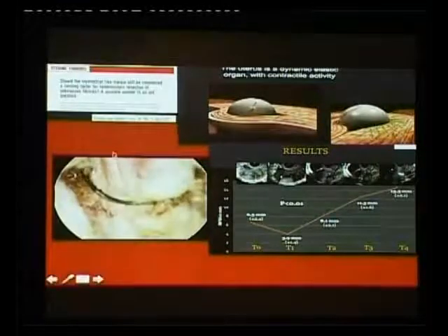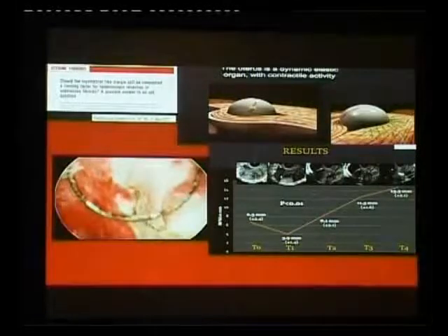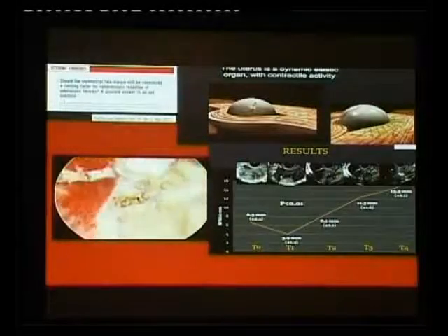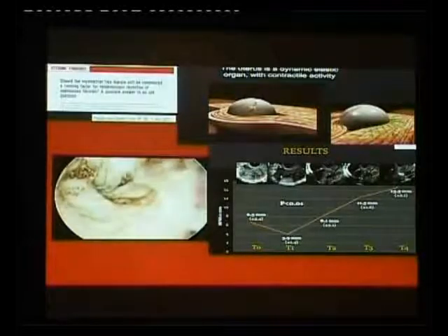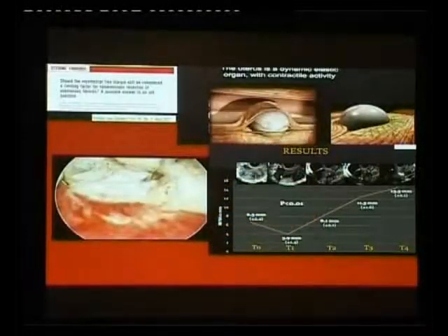And as you can see this study here, when you start it was 3.9 millimeters as the score of the myometrial free margin, but as you removed the myoma and you were monitoring it on ultrasound, it went up to about 13 millimeters. So now we are pretty confident doing this, and sometimes we do it on ultrasound hysteroscopic resection as well.